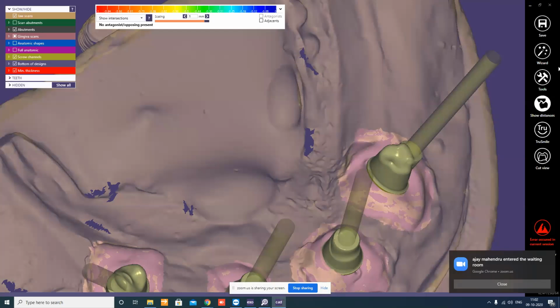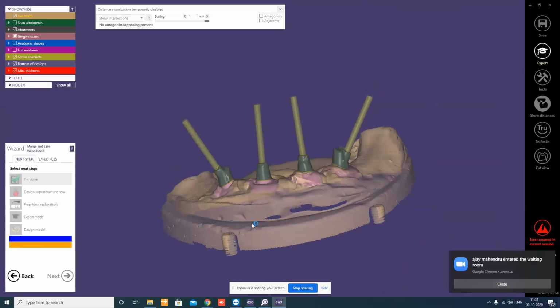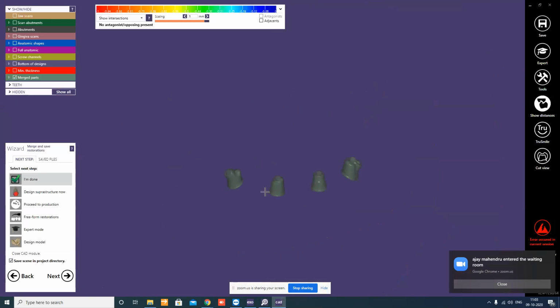And this is customized parallel abutments. Now here the problem is we cannot reduce this area. This is a secured area for the implant access, screw channel access. So it cannot be interfered with here.